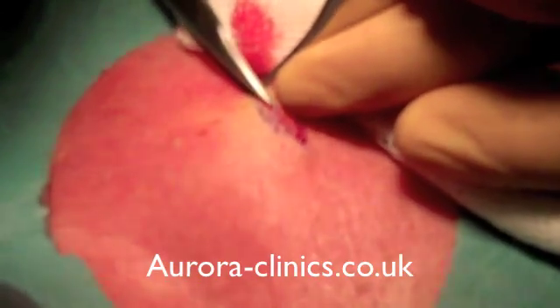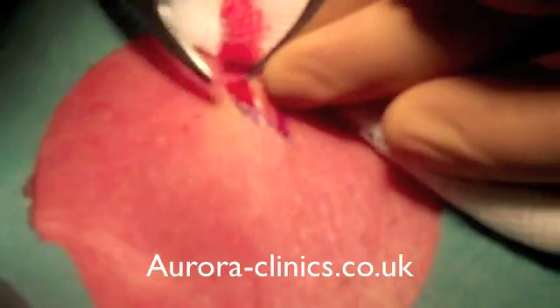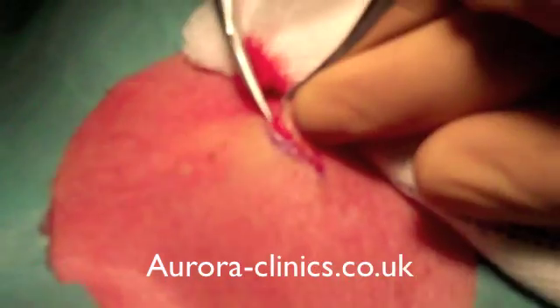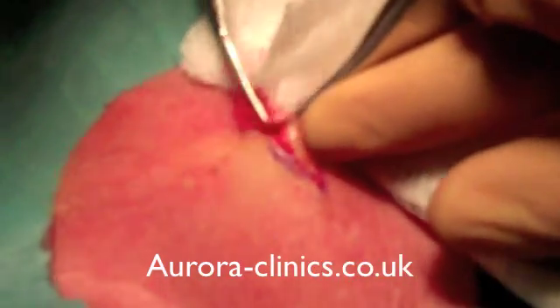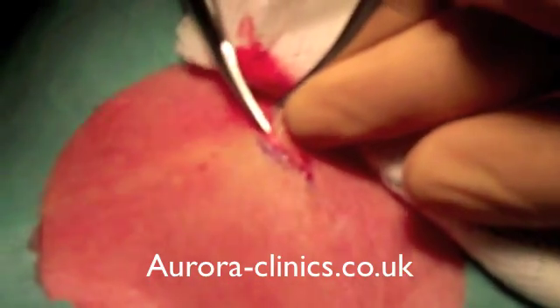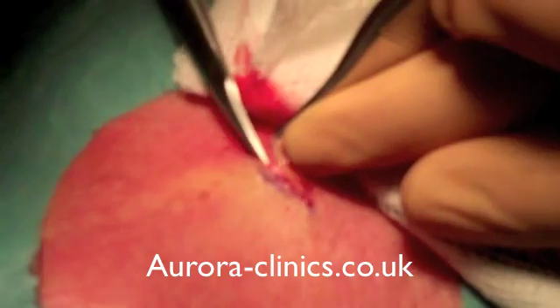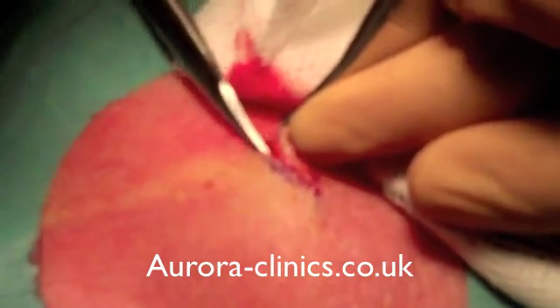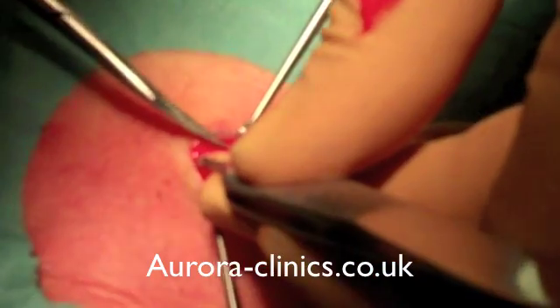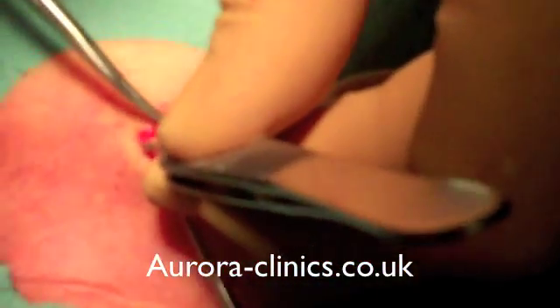Then gently with my pointed tenotomy scissors, which have a fine end, I'm just trying to dissect downwards by a mixture of spreading and cutting onto the wall of the cyst. On a fresh cyst — this one has previously been infected — on a fresh cyst it's much easier. You basically cut down until you see the white glistening surface, spread onto that plane, and then cut any material above that.